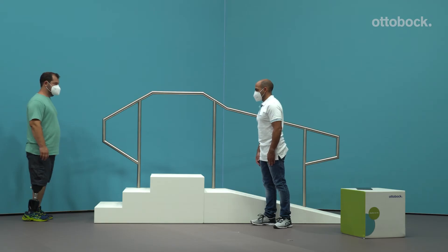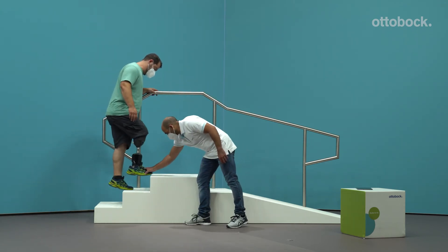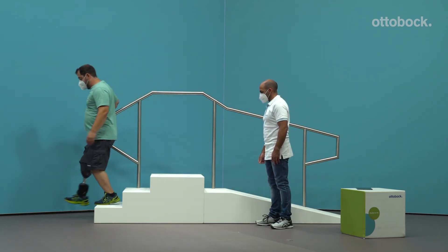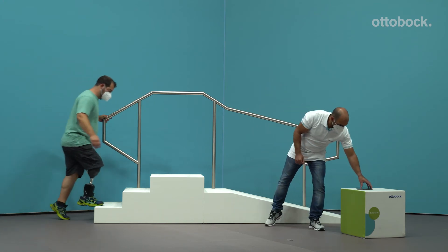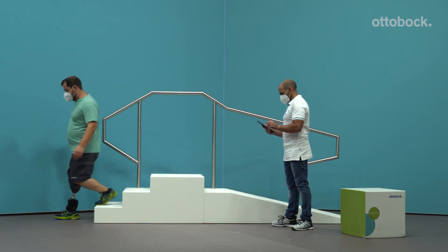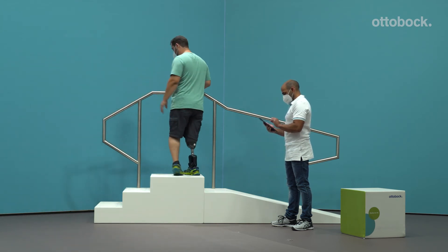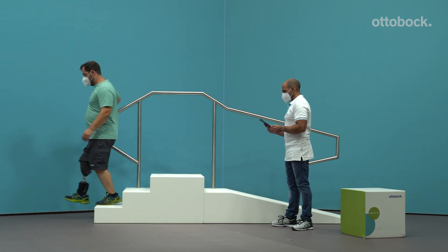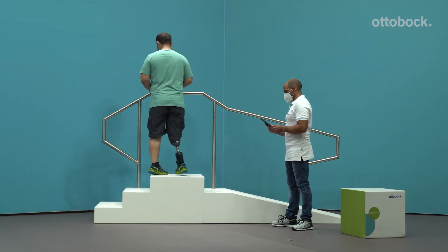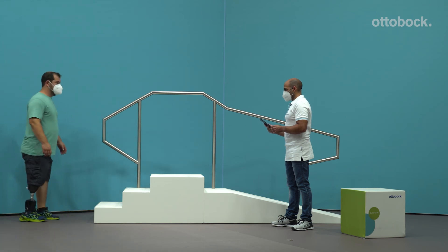The user reports the power output during stair ascent is inadequate or inconsistent. Start by verifying the user is applying the correct foot placement and weight transfer when climbing stairs. The active plantar flexion for climbing stairs is only triggered if the user applies their full body weight on the toe area without making contact on the heel. If this does not resolve the problem, increase the setting for fast walking power by 5 and increase virtual dorsal plantar flexion to plus 30. Verify level ground walking steps still plot in the optimal range of the power output graph. If the power output is too high, increase the cadence range by increments of 5 until the steps plot within the normal range of the power output graphic.